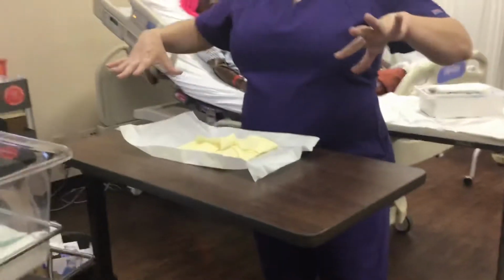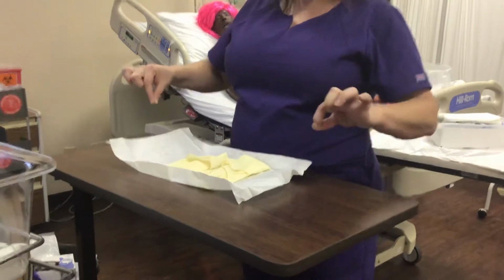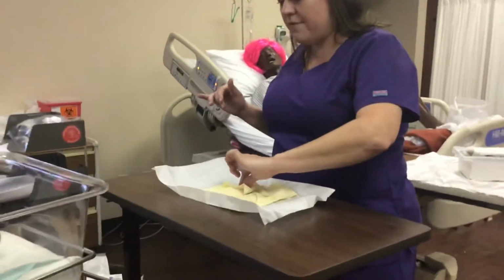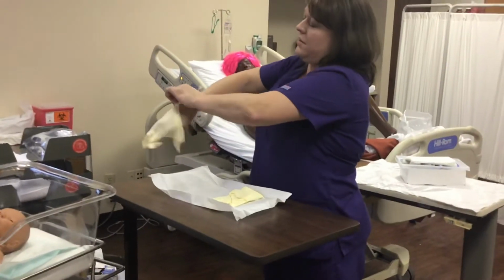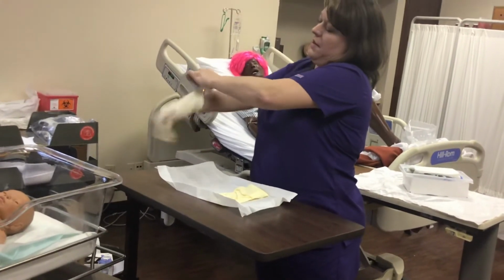Again, making sure that my fingers are always on the outside edge of that paper. All right, now with my non-dominant hand, I'm going to grab the cuff and glove my dominant hand, being sure not to touch the outside of the glove.